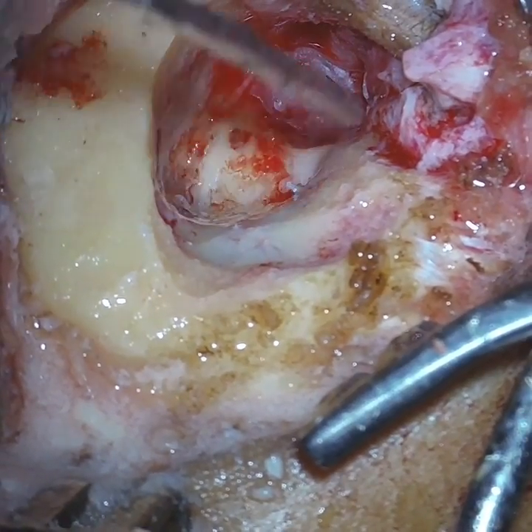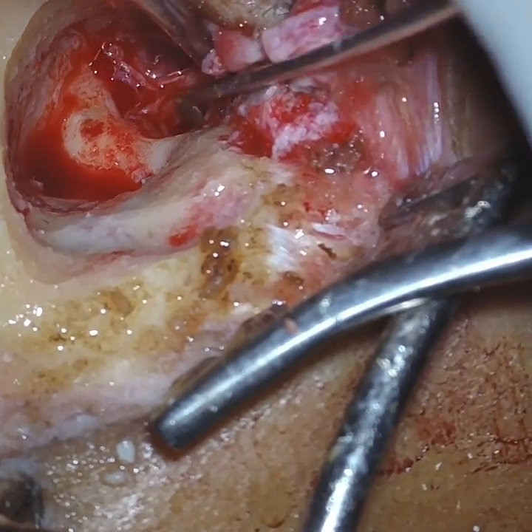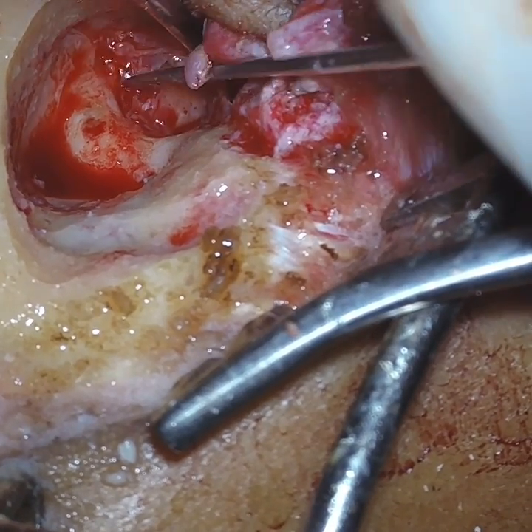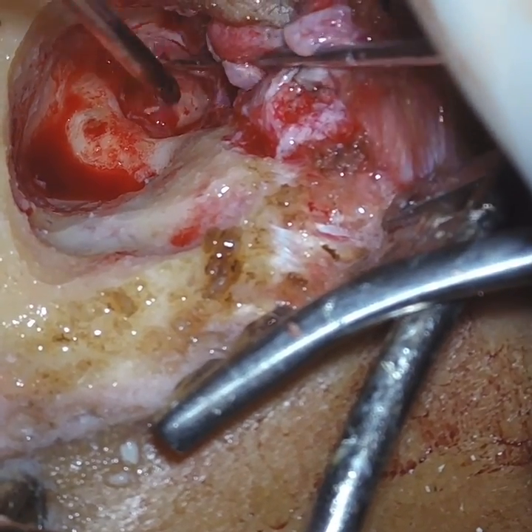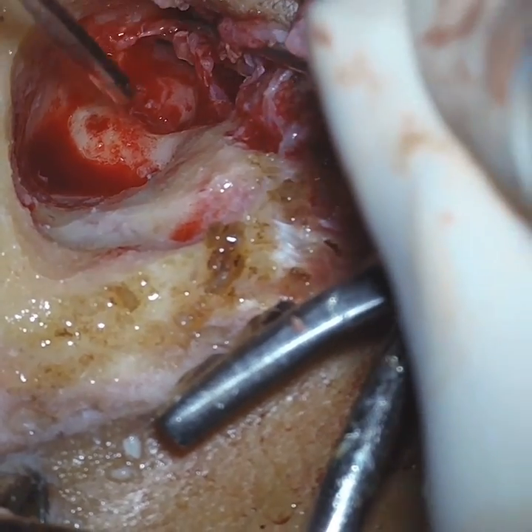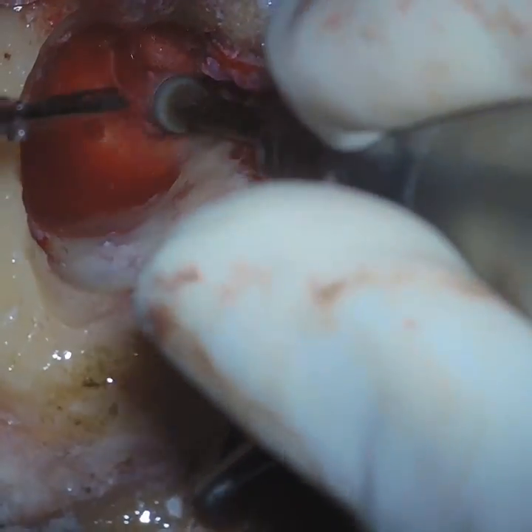So now the full annulus area we have exposed, and this is the full retraction pocket that was there. It was completely adhered to the promontory, the tympanic membrane. So we have lifted the tympanic membrane, and once we have lifted it, this area is a posterior buttress. It can sometimes cause failure even after a big myringoplasty. So try to remove that area fully.